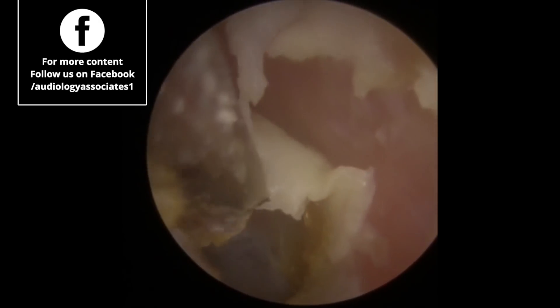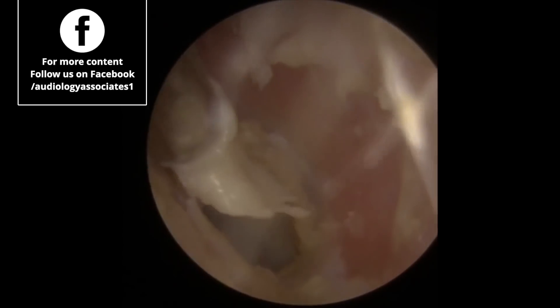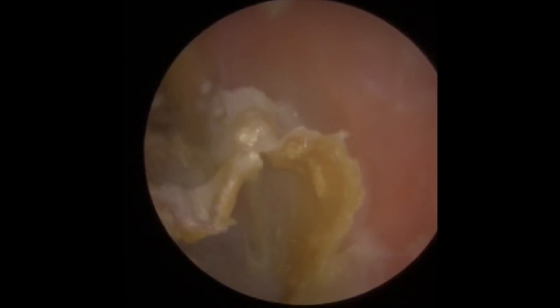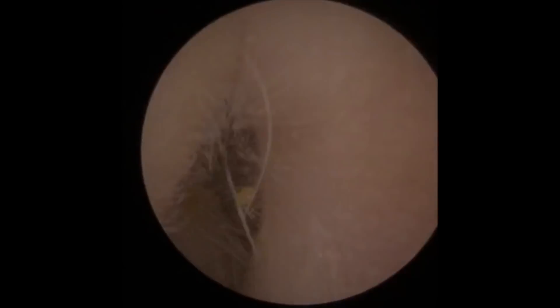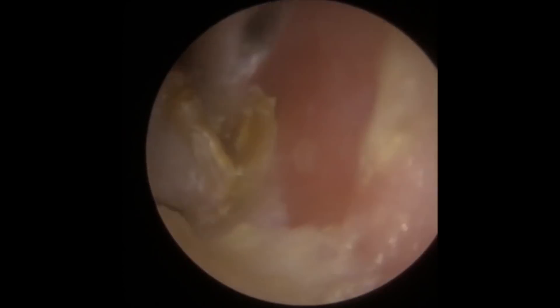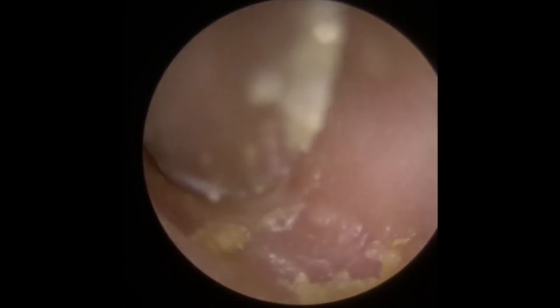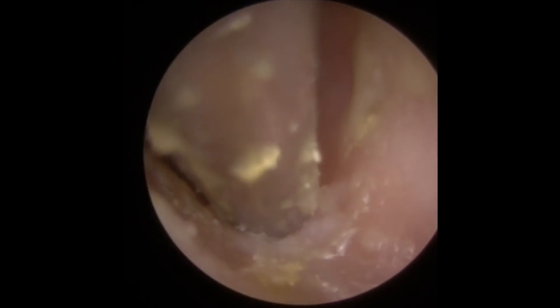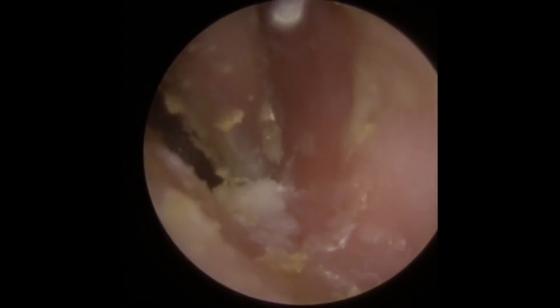Now what you'll see is that it actually goes down very deep — it's sitting almost directly on top of the eardrum. You can see it around the outside edge, so we're just peeling this away. We've got a good loop there, so if we can get into that little gap we should be able to get this out with the crocodile forcep. It's moving quite a bit — the gentleman had a slight tremor which was causing the camera to move slightly, making it more difficult to clear, especially close to the canal wall. We don't want to dig into the canal wall because that could risk causing some bleeding. I'm just taking away some of the older skin debris around the outside here.